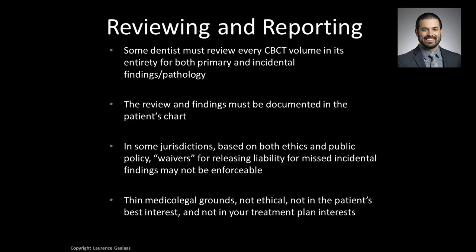In some jurisdictions, what I've heard happening and experienced happening is a patient will come in, for example, for a scan for implant site number 3, and the patient signs a waiver saying this office is only taking the scan for implant number 3. We're not going to pay attention and we're not liable for anything else on the scan. In the United States, that may be legally fine, maybe not. So my advice is to consult with your own legal counsel to clarify your exact situation, if you're part of one of those relationships or clinical operations.